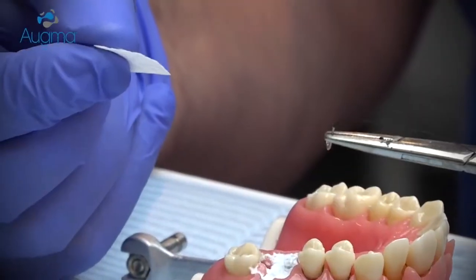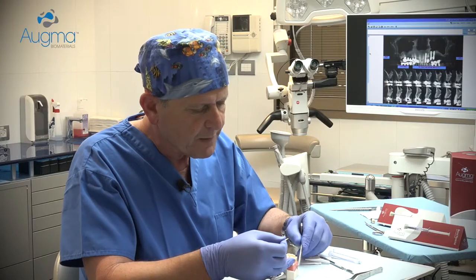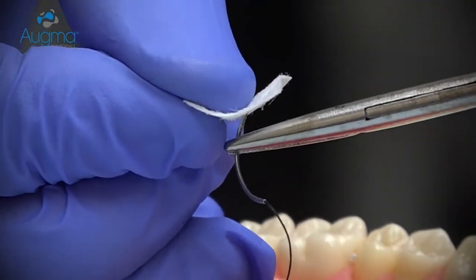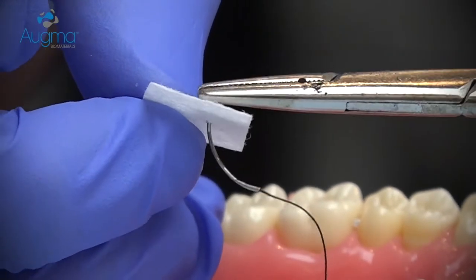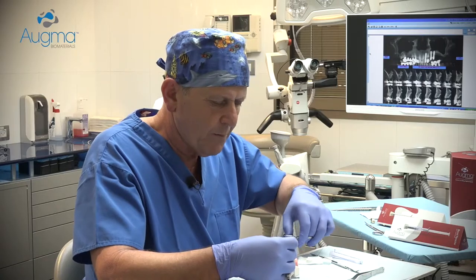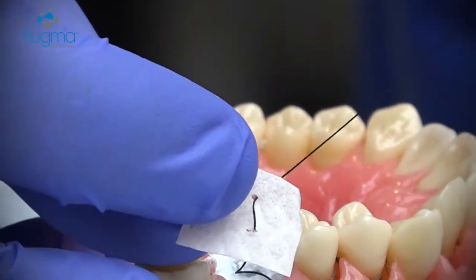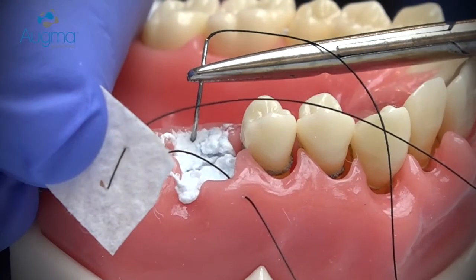So the technique is as follows. Hold the collagen sponge in your hand. Insert the needle from the buccal aspect, insert it to the bottom of the collagen sponge, and from up to down. Insert the needle into the lingual aspect.